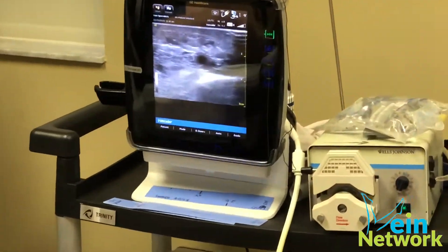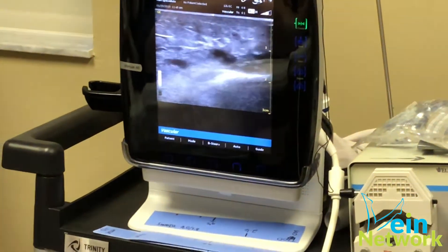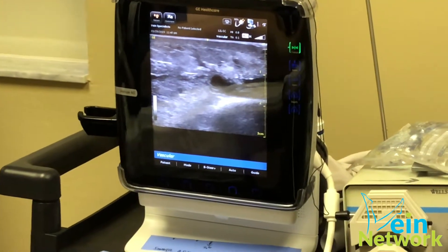You see the screen right there? See that vein that I'm squeezing right there? The white one?